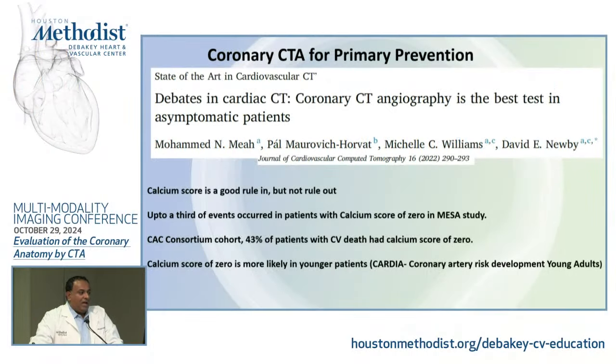This is, are we ever going to get to a point where coronary CT is used for primary prevention? This is from Dr. Michelle Williams and Dr. Newby. Dr. Michelle Williams was actually the first author on the SCOT-HEART trial. And they talk about the rationale for using coronary CT in some patients, maybe not all patients, for primary prevention.